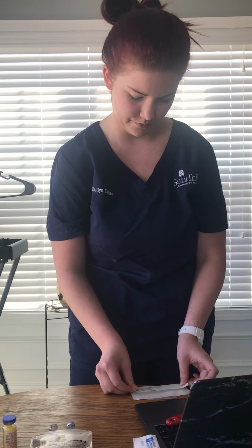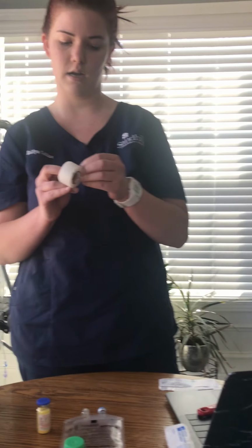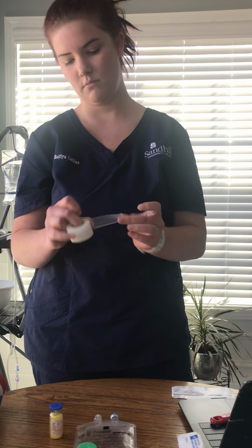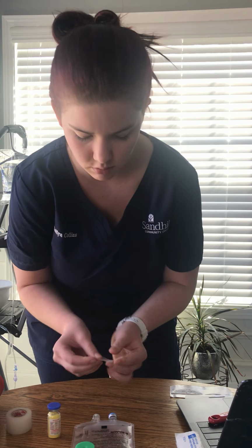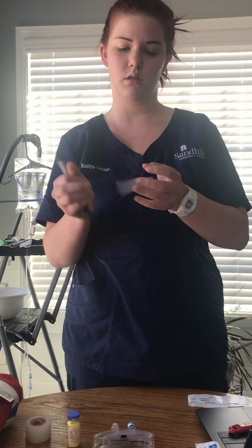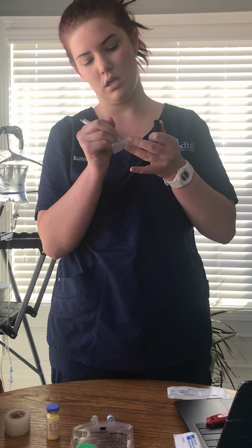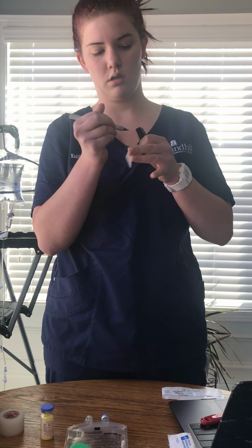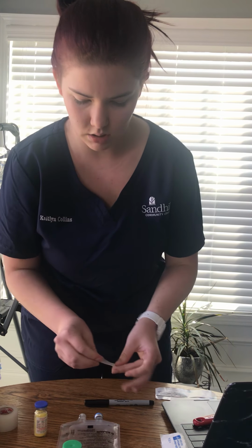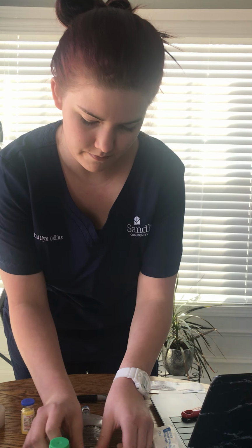I'll label my bag with the patient name, the time, medication, and dose, and all of that. Put it where it will not be in the way. Okay.